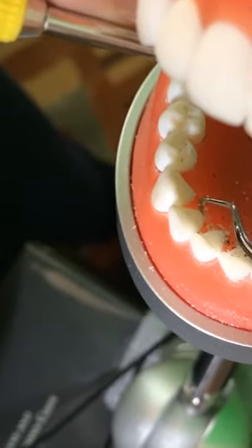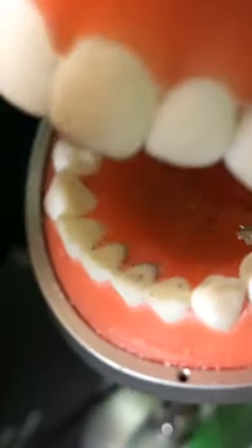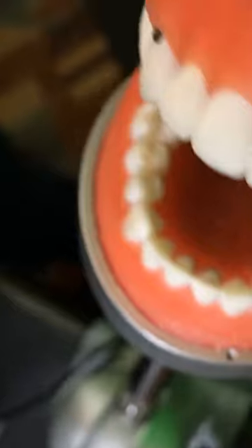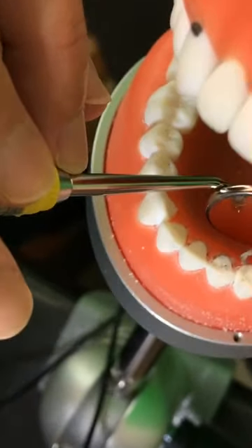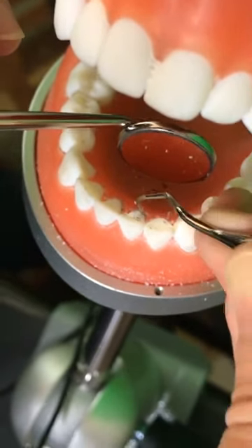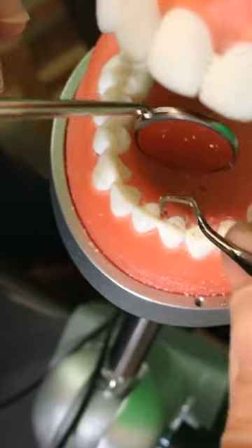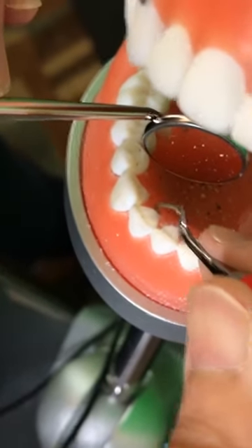Let's practice again — surfaces towards at 8 o'clock, 13-14 Gracey, toe down. Patient, please look away. Facial fulcrum — the canine is a little hard. I'll go right here. I'll finish all the surfaces towards from the lingual — all the lingual surfaces, the half surfaces towards, right here.